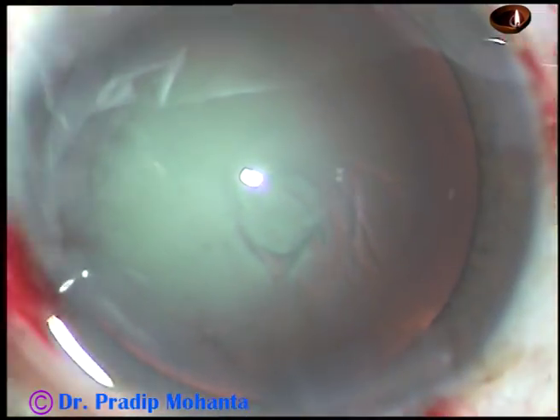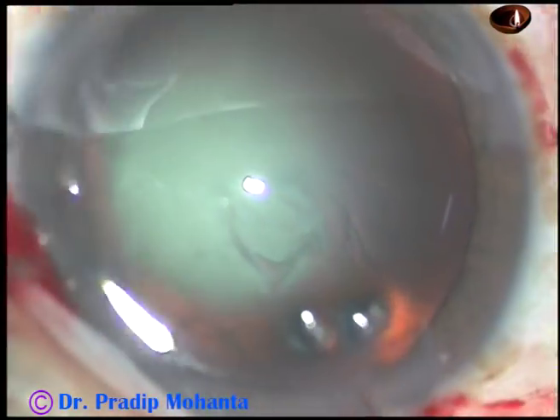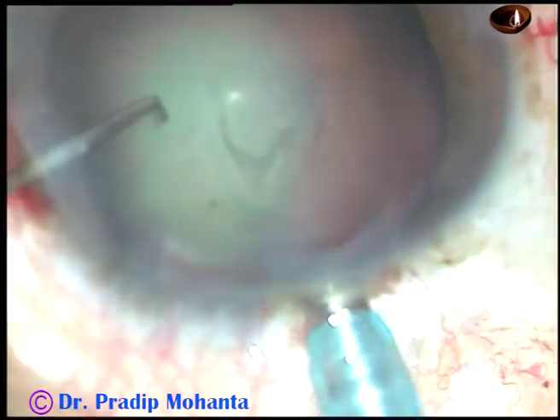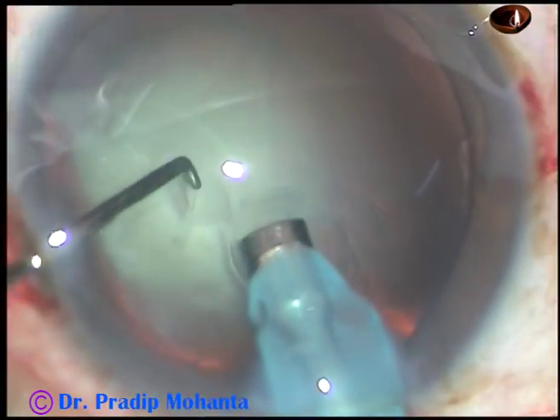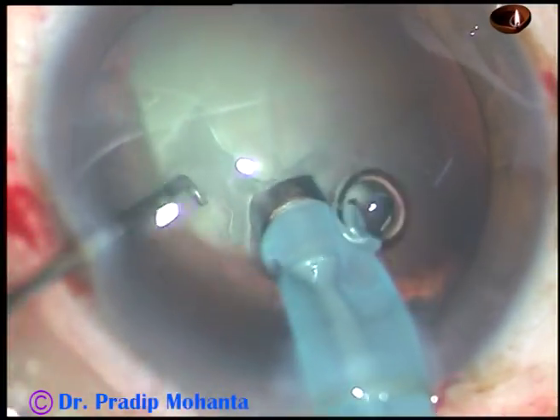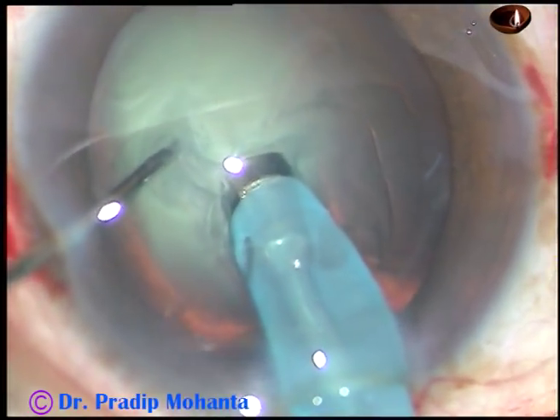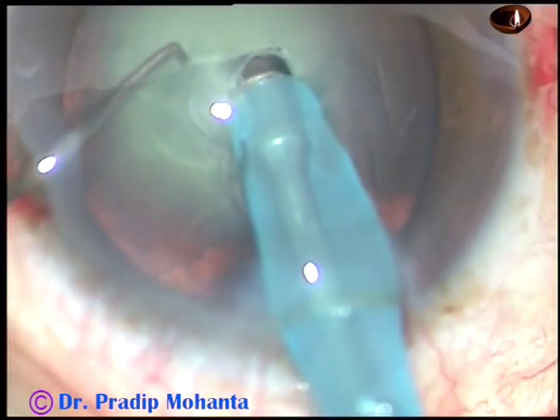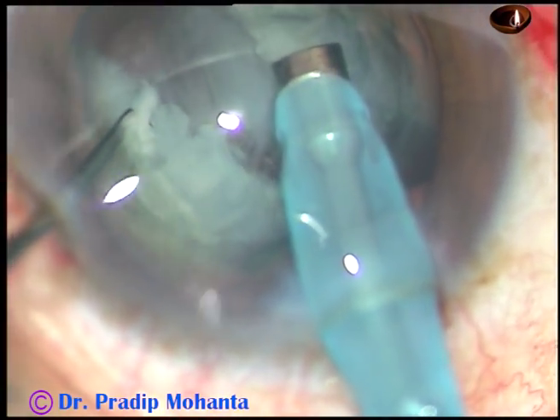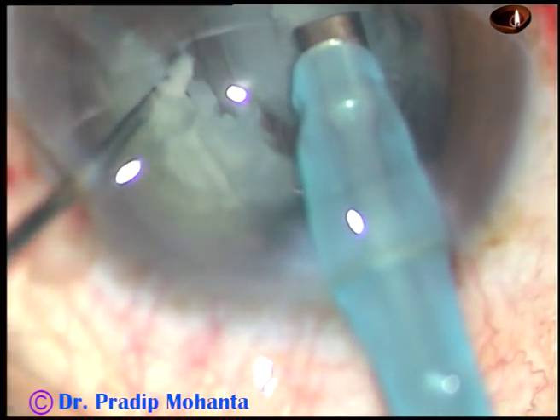The machine being used in this case is Oertli Catarhex 3. I am in phaco 2 mode from the very beginning with 450 vacuum and 45 flow rate. Bury the tip totally into the substance of the nucleus and chop it. Ultrasonic energy is about 60%, and see what happens.